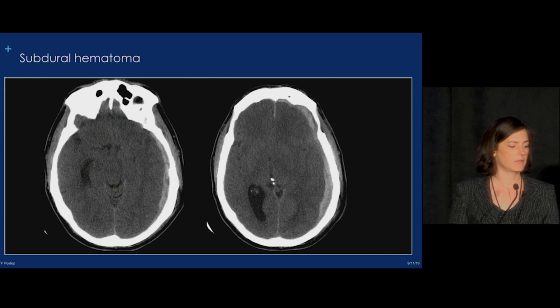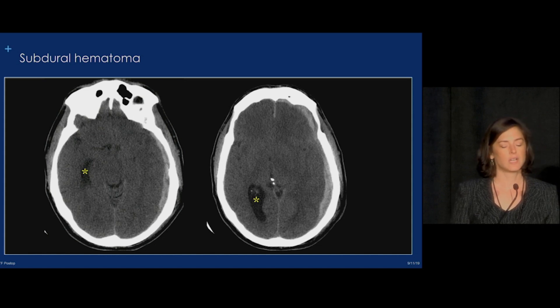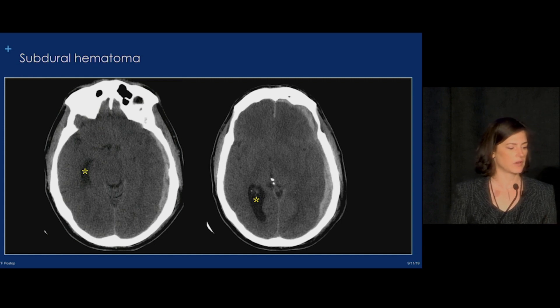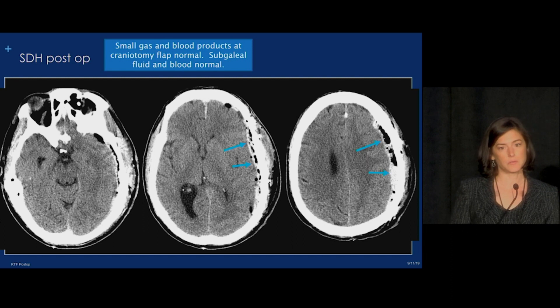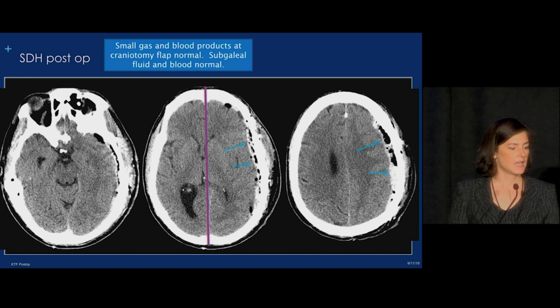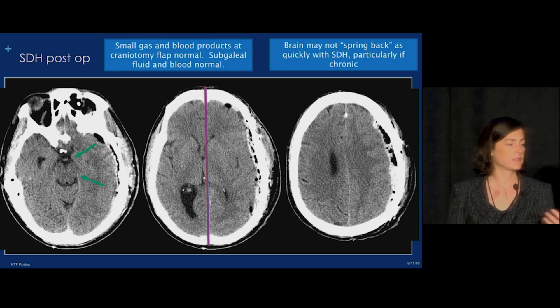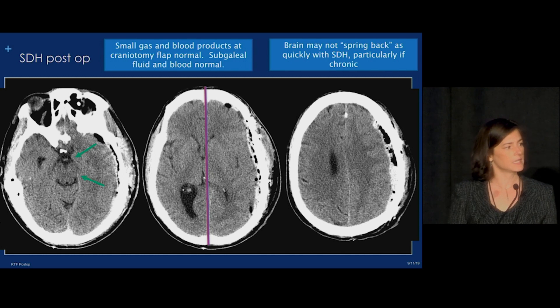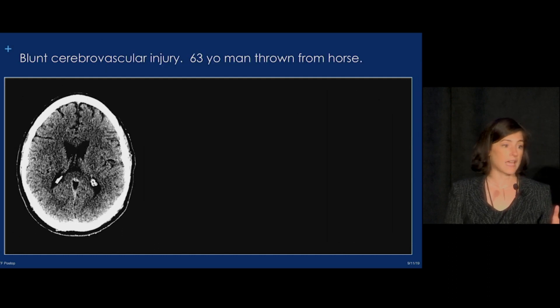Here's another case with a subdural hematoma. There's some midline shift, some uncal herniation, and the basilar cisterns are somewhat effaced. We also have some ventricular enlargement on the contralateral side, indicating some entrapment. The patient was taken urgently to OR, the subdural was evacuated, and we see extra-axial blood products and gas at the resection site. There is still some midline shift, but the uncal herniation has definitely improved. With subdural hematomas, the brain tends not to bounce back as quickly, particularly if the subdural is chronic or the patient has volume loss.